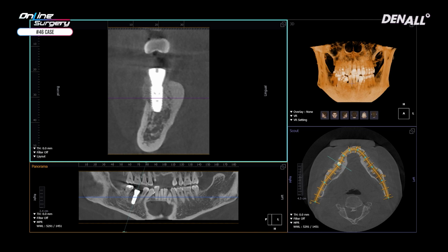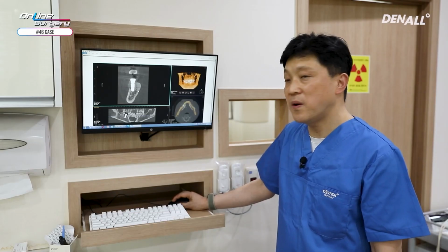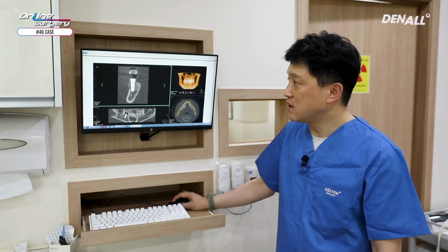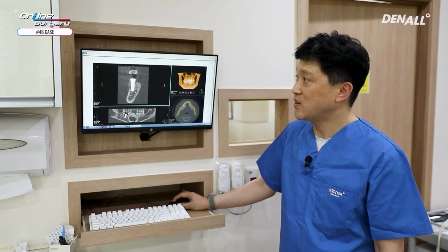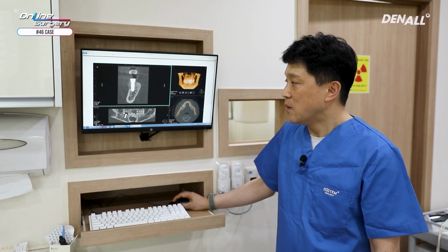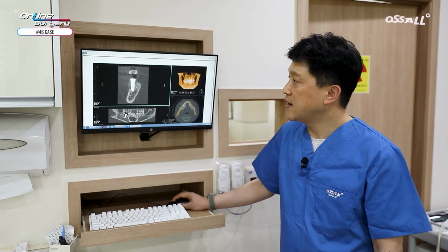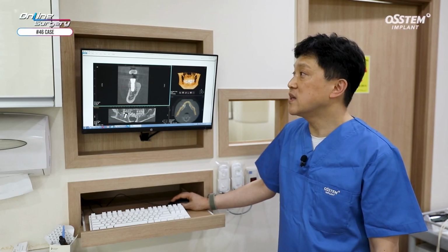The implant is slightly placed buccally because the bone here was harder. Although we kept this in mind when we performed the surgery, this was the result we got. In these cases, you need to place implant significantly lingually to get the ideal implant placement position.